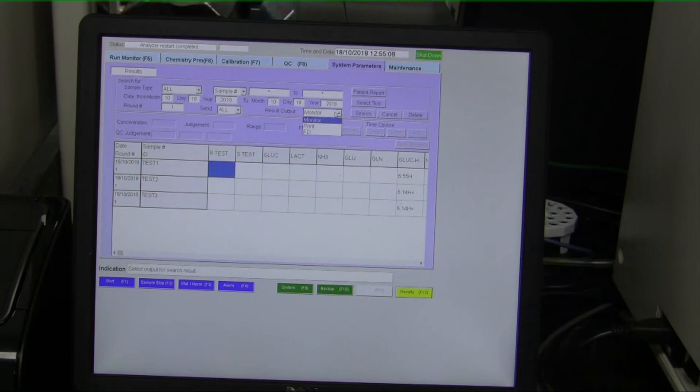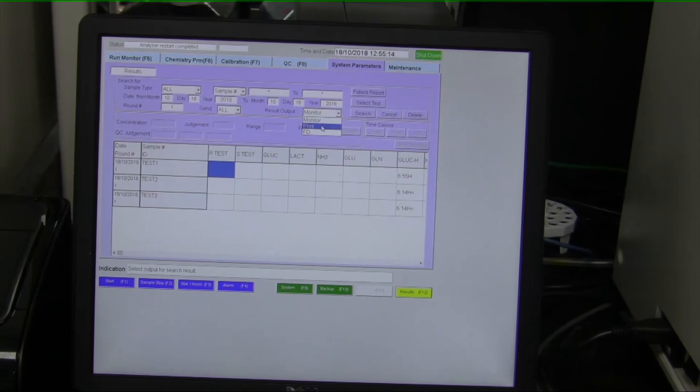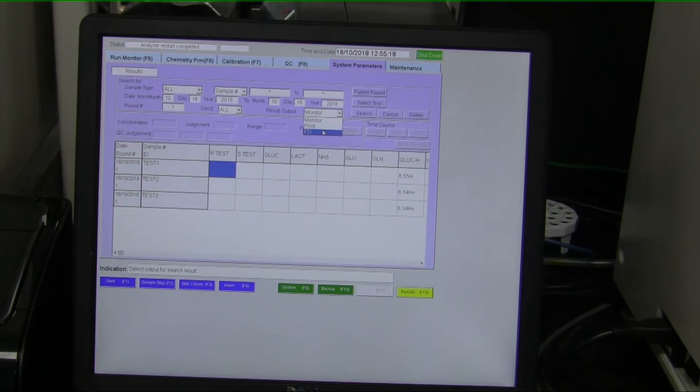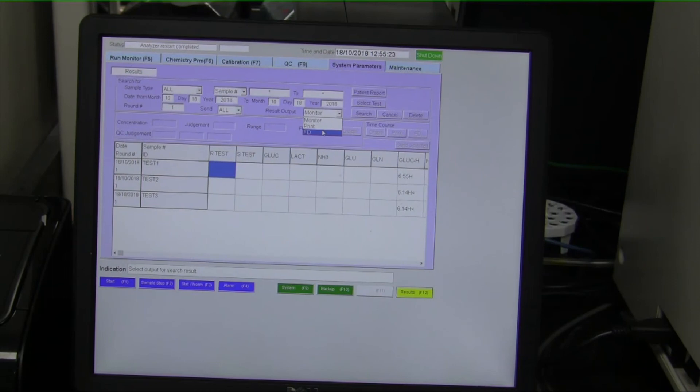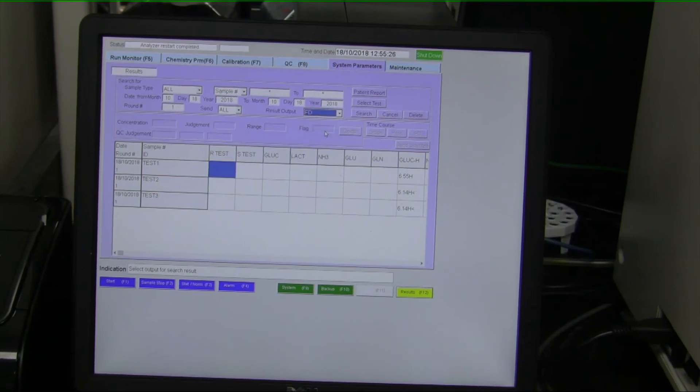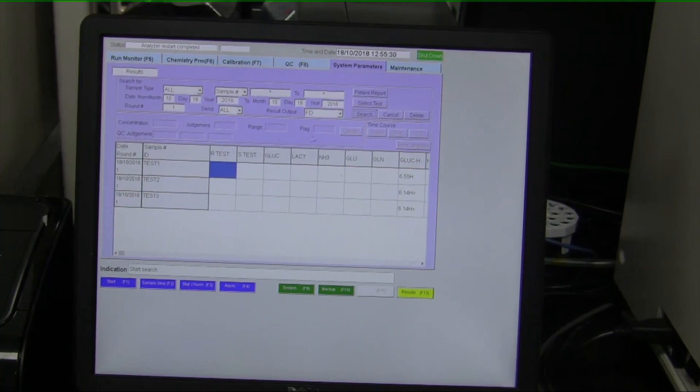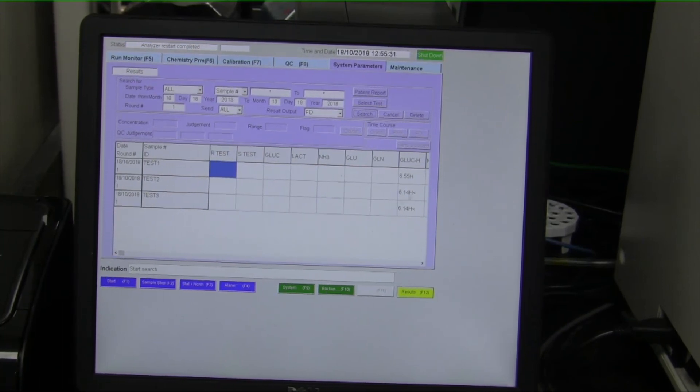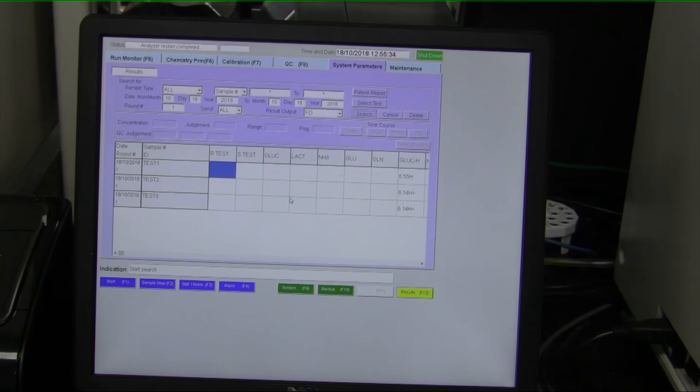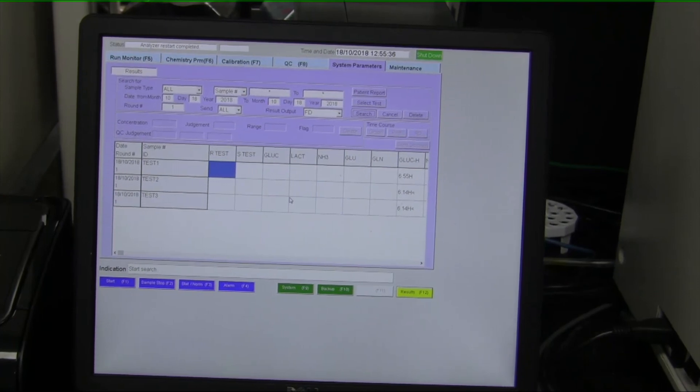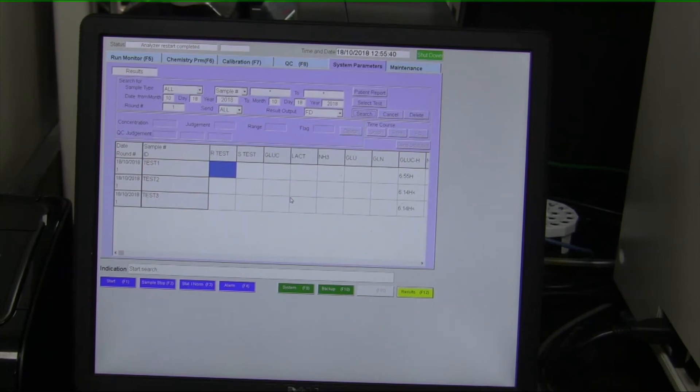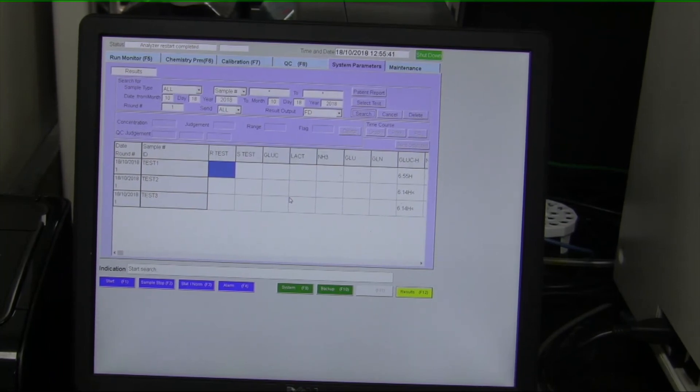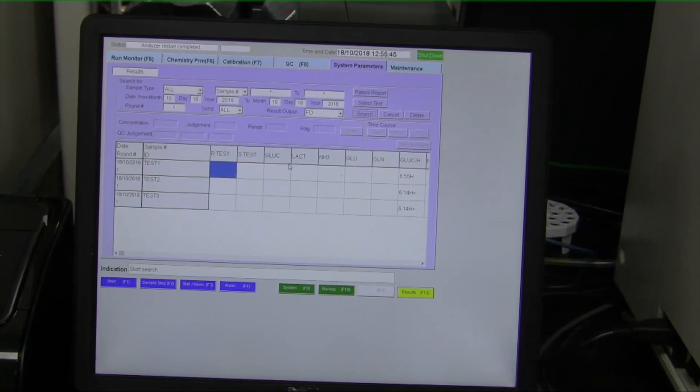There's a couple different options. You can display it only on the screen. You could display it on the screen and print it. That would be a standard 8.5x11 printer. Or you could display it on the screen and export it to a flash drive. So that would be a USB thumb drive that you put into the computer. So if we select Flash Disk and then we click search, it's going to show up the same as on the screen here. But what's going to happen is that on a USB stick that you have in the computer, there's going to be a CSV file created, and that CSV file is going to be able to be opened in Excel, and your data is going to be ready to be viewed on a different computer.